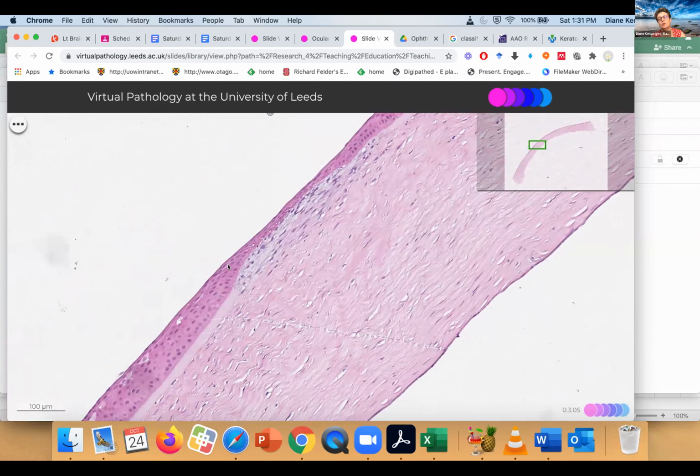Because if it was chronic, we probably wouldn't see the intraepithelial inclusions here. Can you see inflammation? Are those cells inflammatory cells? No, there's no inflammation at all. If this is a well-healed scar. I was just trying to remember whether or not, I guess you would with a herpetic cornea still have a few lymphocytes hanging about. Yeah. Oh, no inflammation, non-inflammatory scar.